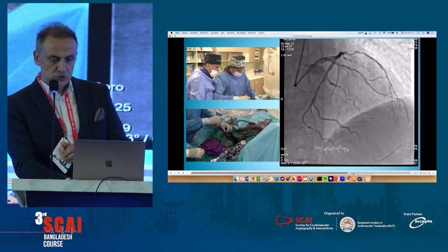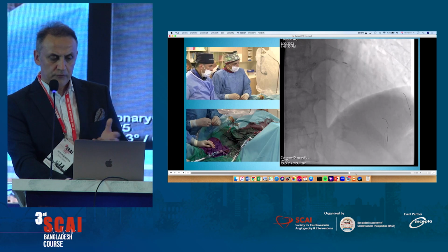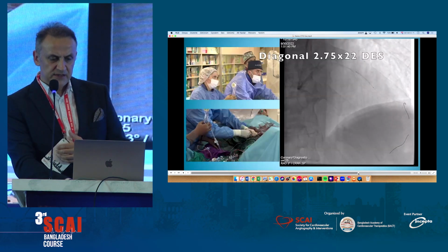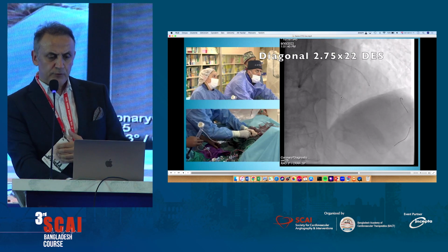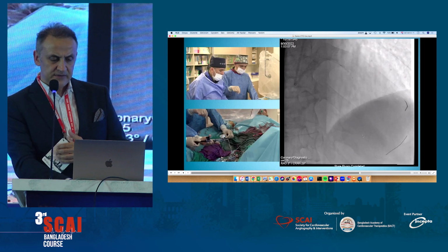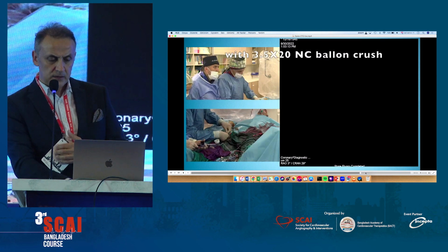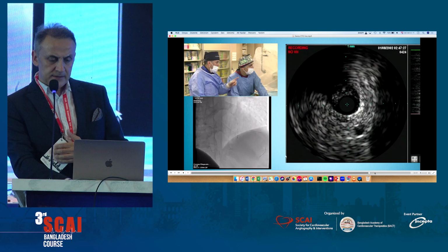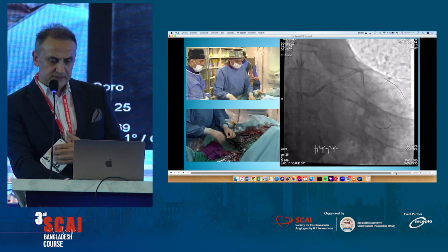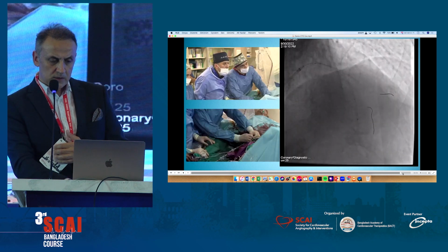And then, as usual, we did ballooning. We did, of course, IVUS to size, and then to see the final result, we did IVUS. We thought the diagonal is important and important to stent because it was diseased. We did here double kiss mini crush and some work and evaluation. And I'd like to show you the final results since I finished my time.